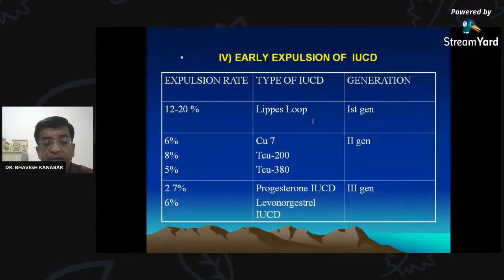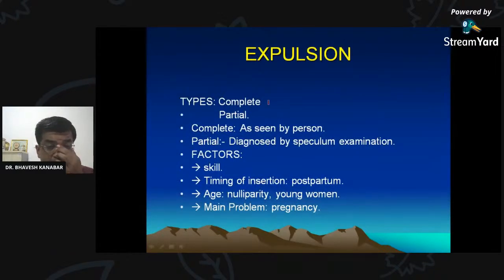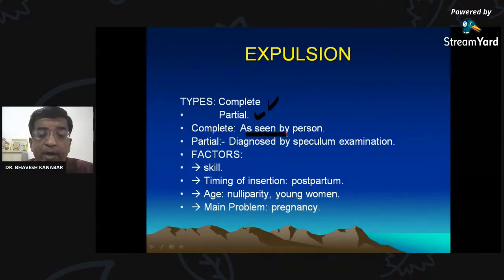Early expulsion rate we have already discussed, so I am skipping this. Expulsion can be complete as well as partial. Complete is what? As seen by the woman herself, she says that this device has been expelled out. So that is complete expulsion. And partial expulsion can be diagnosed by speculum examination.